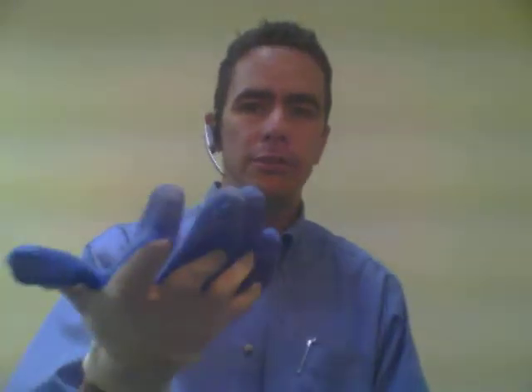I'm always looking to save money for my patients, so I try to pick up alternatives. These are actually ordered in bulk from a hardware supply store, more like an industrial catalog. Unfortunately, although this worked pretty good, it's not the best grip. I've ordered some that were almost hard on the surface, and they just slide against the compression stocking. So if you buy just a regular grip glove from a hardware store, it may work really well, or it may not work hardly at all. It might be real slippery.